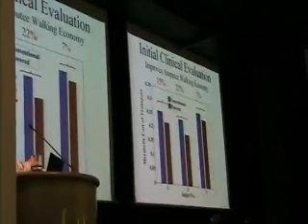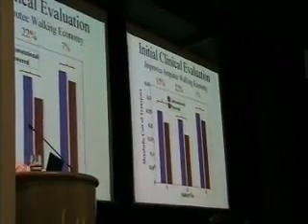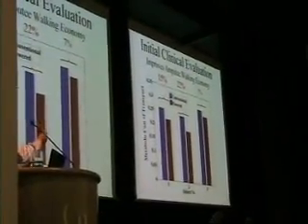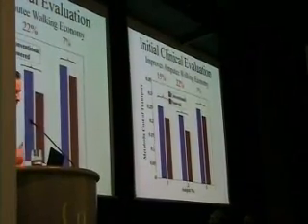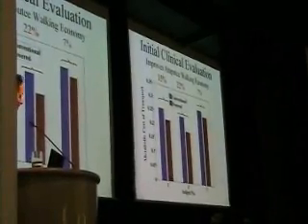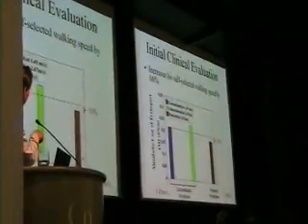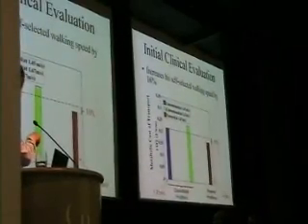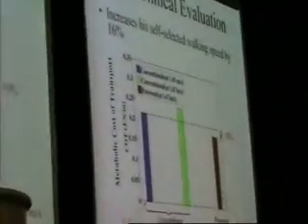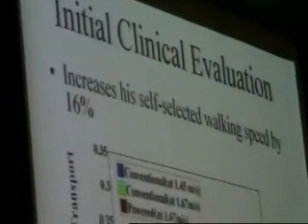A unilateral, below-knee amputee has about 10 to 20% higher energy than a normal person. So these numbers suggest that we are very, very close to normalizing metabolism. One of the subjects, we were actually able to increase his self-selected walking speed, and even at that higher speed, we were able to lower his energy by 10%. So with this robotic system, we can have amputees walk faster and even at lower energy.